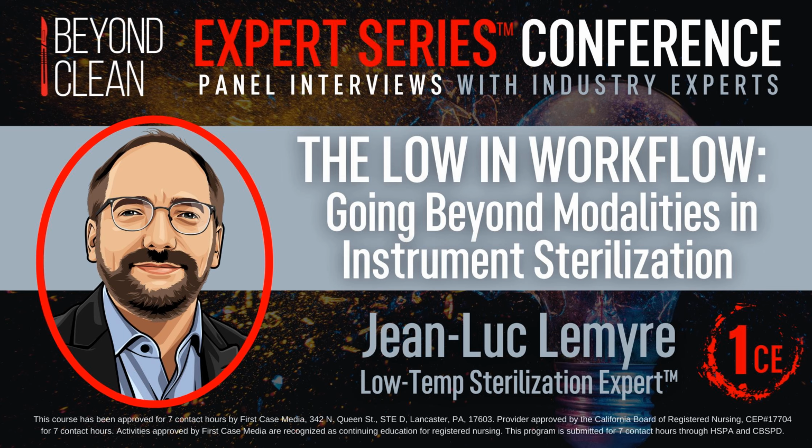I mentioned earlier, when we talked about safety, biocompatibility studies have to be conducted based on the use of the device. So if it's a reusable device to be used on the patient just for a procedure, typically it's done with the part of the standard that deals with patient contact of 24 hours or lower. So if it's an implant going in for much longer into the patient, maybe the right validation was not done with the sterilizer. So yeah, again, going to the IFU, if uncertain, talking with the manufacturer directly. Yeah, that's really helpful.